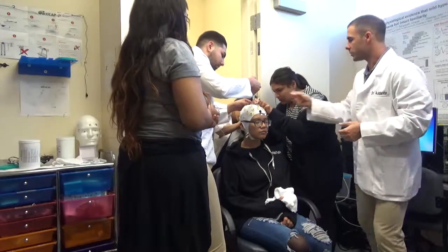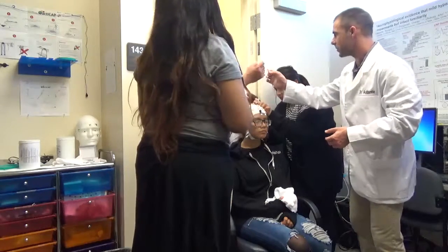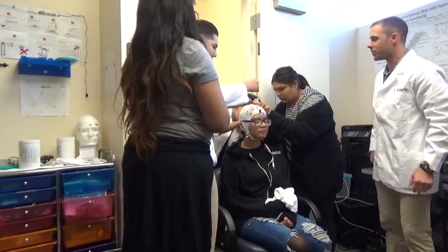Oop, your syringe broke. Nope, that didn't break, you just got to screw it in. There you go. I apologize for my head. No, you're good.